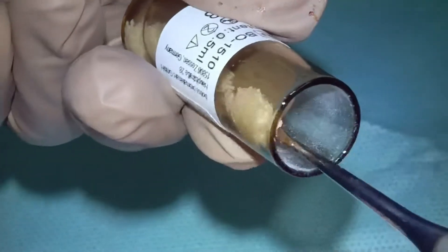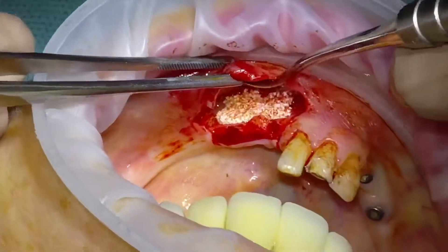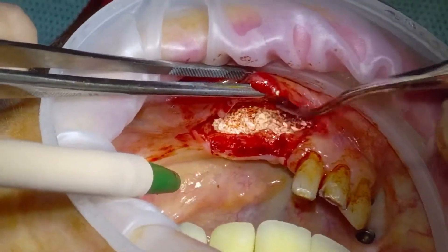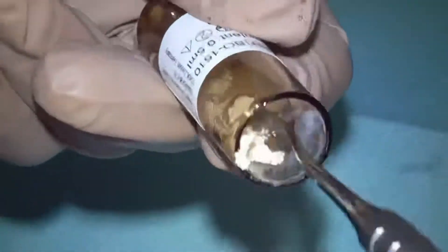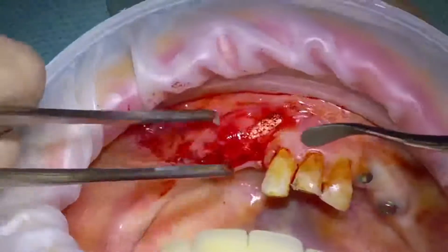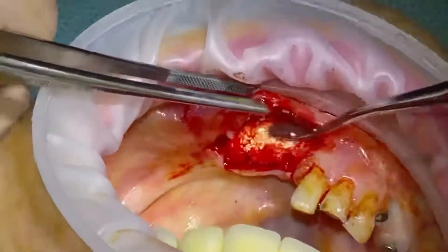Then we just start adding our Cerebone — this is a Botiss product, bovine in origin. It works really well, forms a very solid bone-like material, is very dimensionally stable for a long time, and is easy to handle. You can see I'm packing an awful lot here, hence why I've speeded up the video quite a bit.